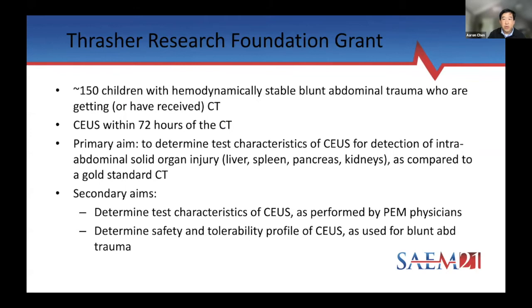I think this is where contrast ultrasound has a real potential to be beneficial, either as a screening tool or potentially even as a direct replacement for CT scan. You can actually look at injuries to the organ. We're not looking for free fluid as a marker; we're actually looking at the organs themselves, as Laura mentioned.